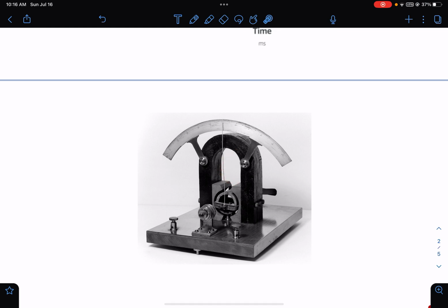That's called the galvanometer. You can see that here is the resting point. At the resting point, it will indicate 0. Moving to the left, it will be more positive. Moving to the right, it will be more negative. Okay, so this machine can detect electrical activity in our cardiac muscles, in our cardiac myocytes.